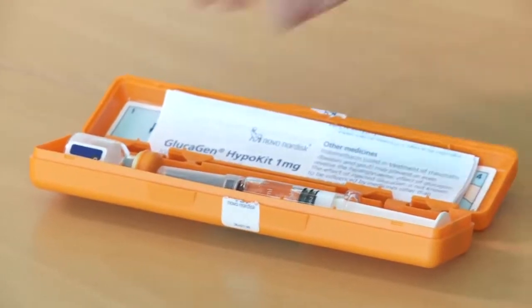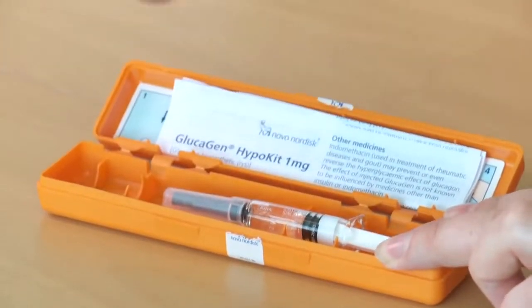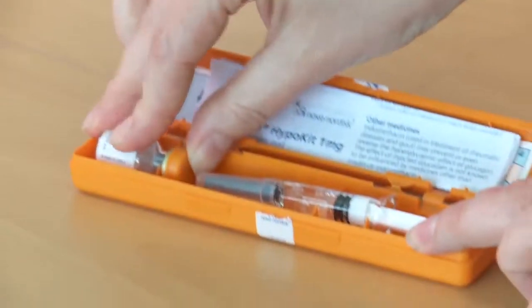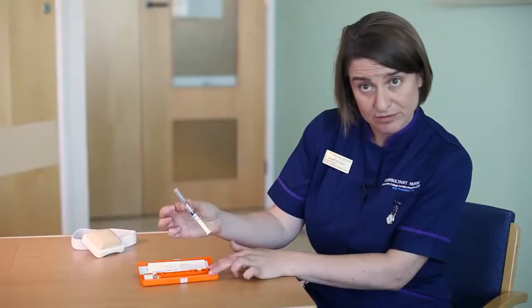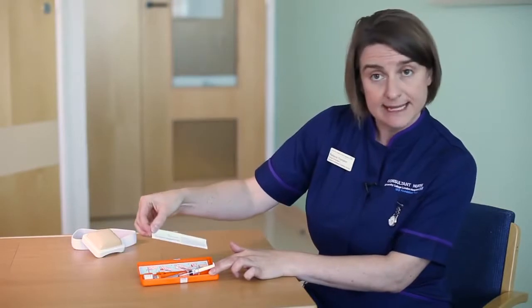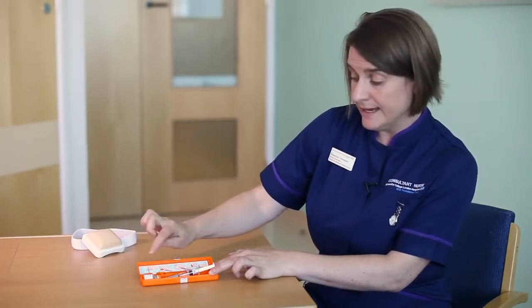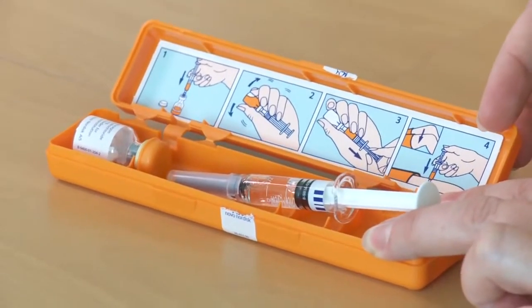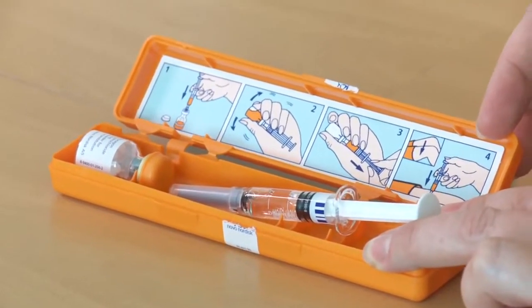So in the box, you have a vial containing powder. You have a syringe containing water already drawn up for you. There's details about the drug, and then underneath there are pictures to remind you how you're going to give that injection. So I'm going to show you how to draw it up.